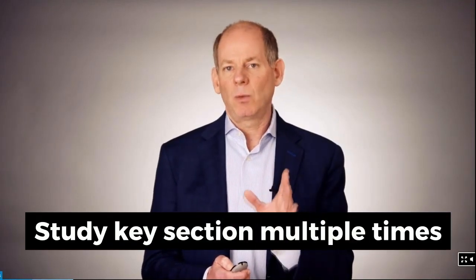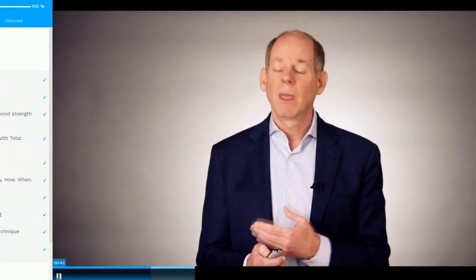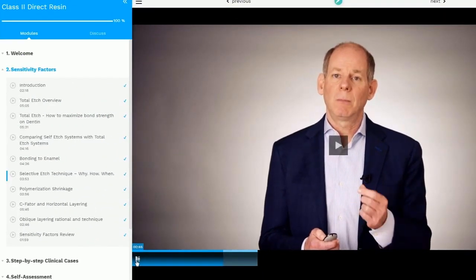Now, the nice thing about enamel is that minimally you want to etch it for 15 seconds. That is if the enamel has been prepared. But if you have unprepared enamel, it's important to etch it longer. So you want to etch it for 30 seconds or even longer. You want to rinse off your etchant and dry it completely. If you're an experienced clinician, you remember when we used to etch the teeth, we would rinse off the phosphoric acid and then dry it and you would see this frosty appearance on the enamel. Well, that's exactly what we want.